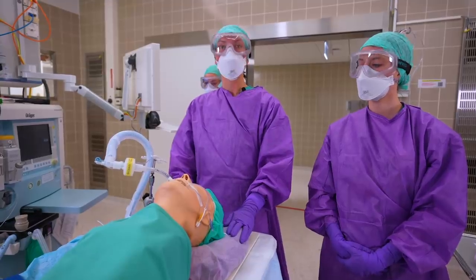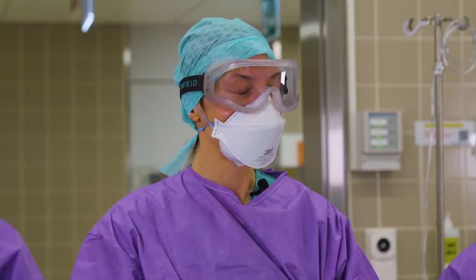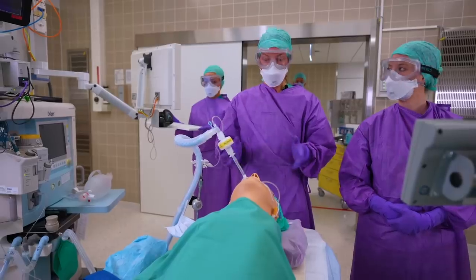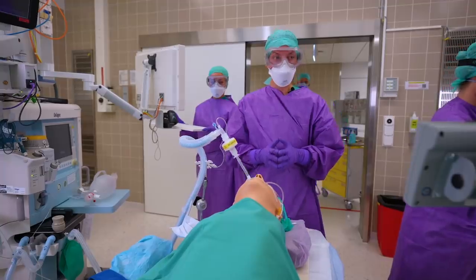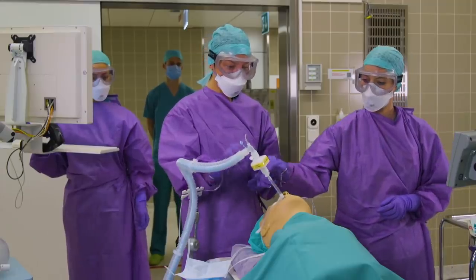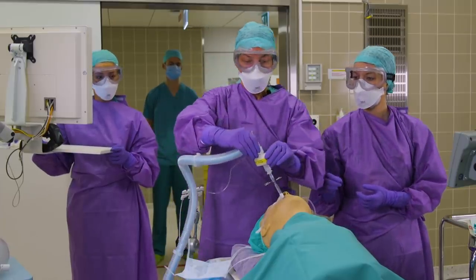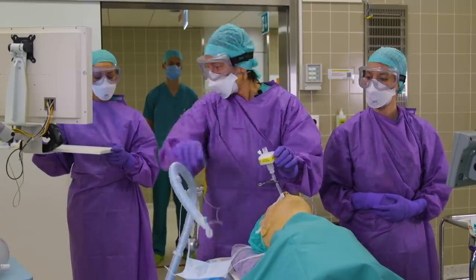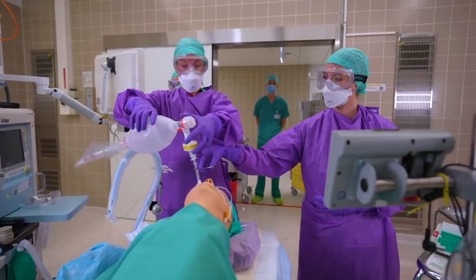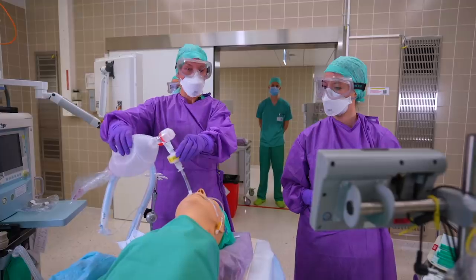Intraoperatively, we are utilizing lung protective ventilation strategies, i.e. a tidal volume of 4 to 6 cc per kilogram ideal body weight and a PEEP. If you are transporting an intubated patient to the ICU, make sure that you clamp the endotracheal tube in inspiration before you disconnect and reconnect to your bag-valve mask. We are saving our transport ventilators for use in the ICU, and hence currently we are utilizing bag-valve masking for transportation of ICU patients.